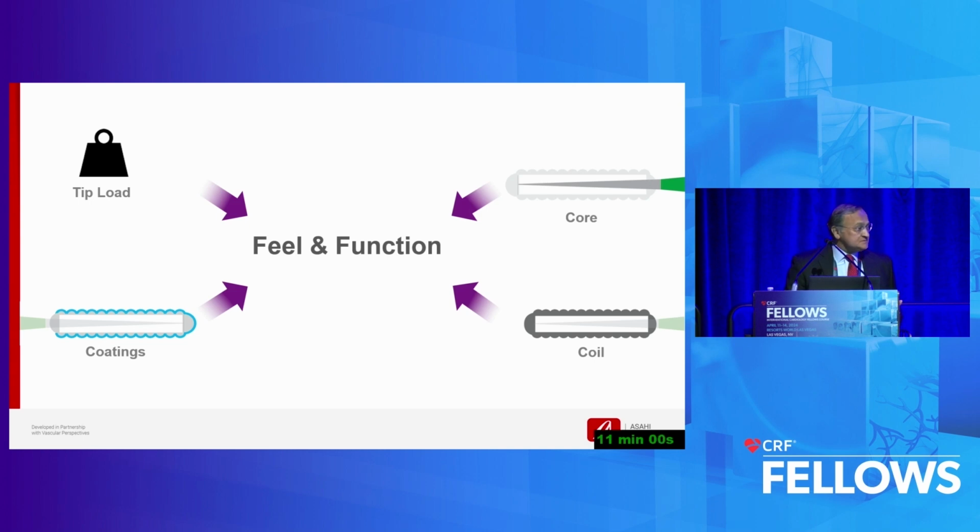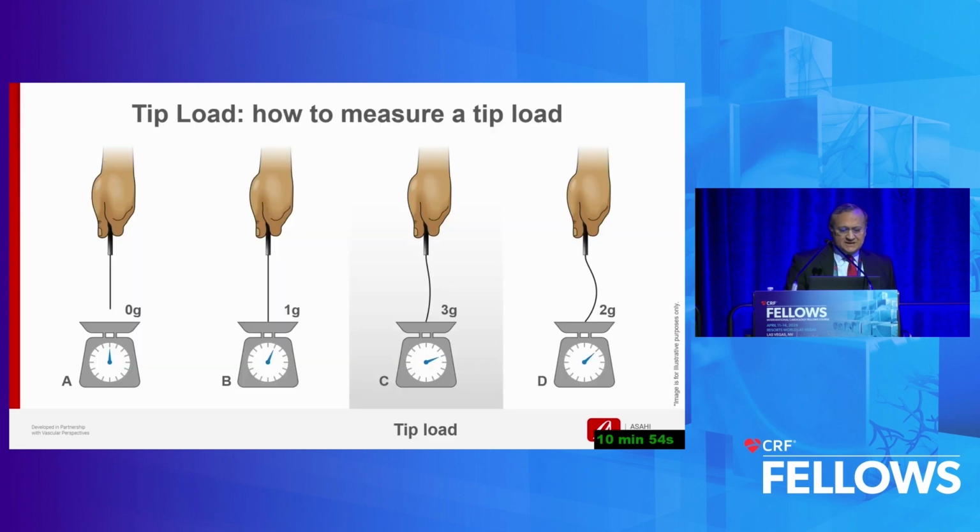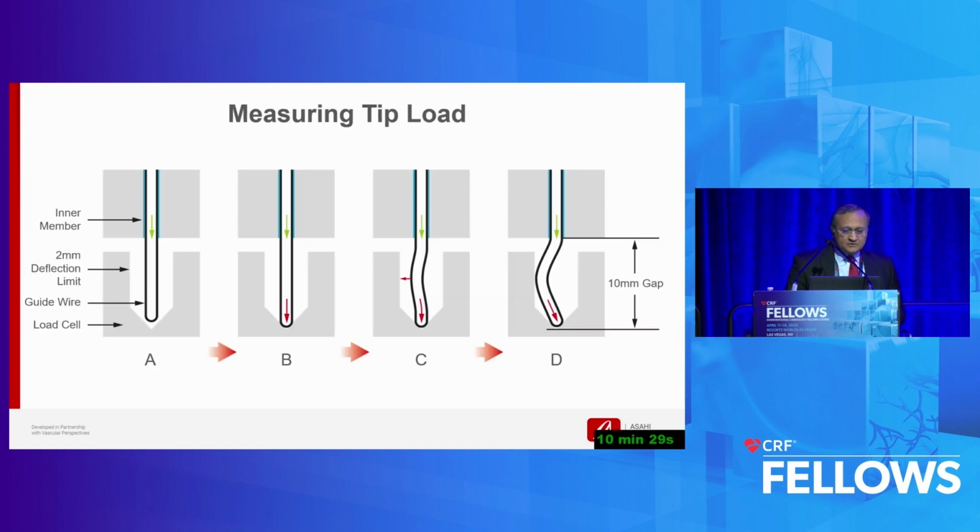Because it just doesn't. It's like, why isn't every car the same? Or why isn't every stent the same? It just is not. So again, the tip load, as I said, is 2 millimeters of deflection as it's anchored, and you have from 0.5 grams all the way, as Margaret said today, to 20 or 40 grams for periphery. 40 grams, it's a spear, right? So very different tip loads of force or power in order to cross a lesion.